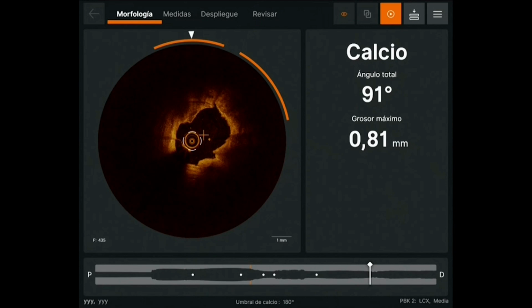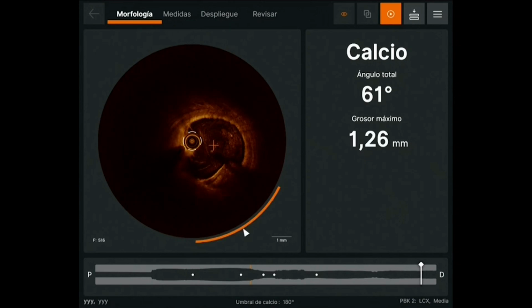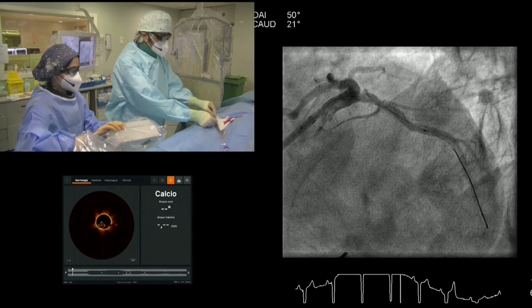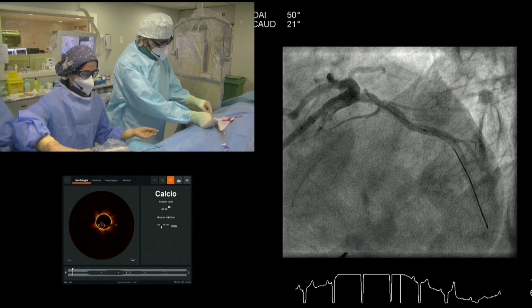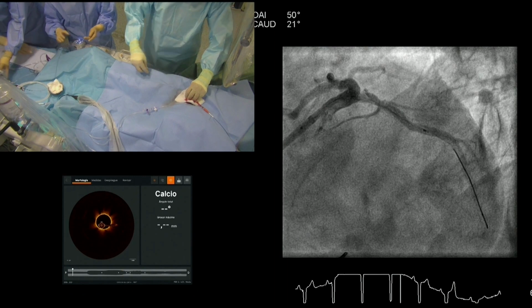What is also evident is the very significant increase in lumen area obtained with these dilations with only 4 atmospheres, but using the Shockwave system. So very good. I think it's very convincing that the plaque has been nicely modified by IVL. We move now to the MAX, which stands for deploying the stent first, and then checking for medial dissection, apposition and expansion. Yeah, and expansion.